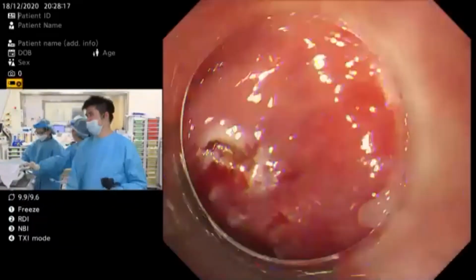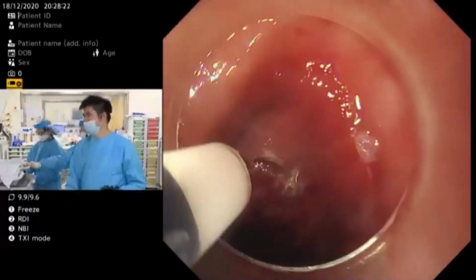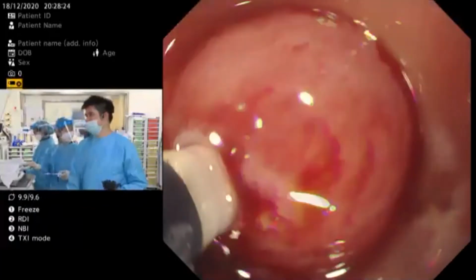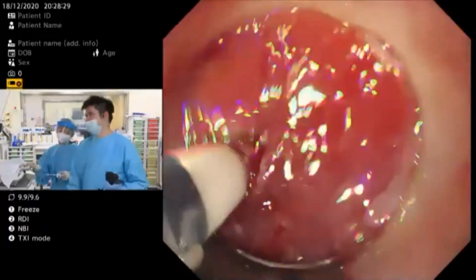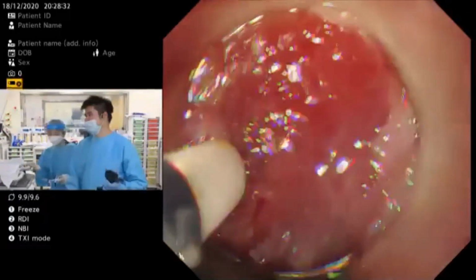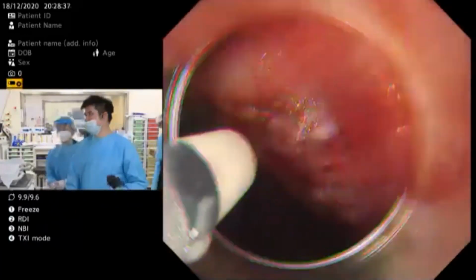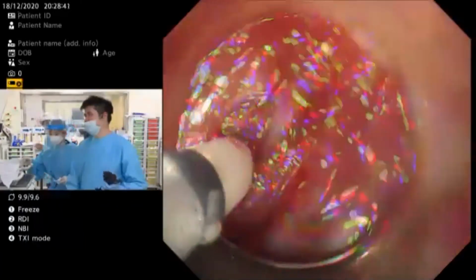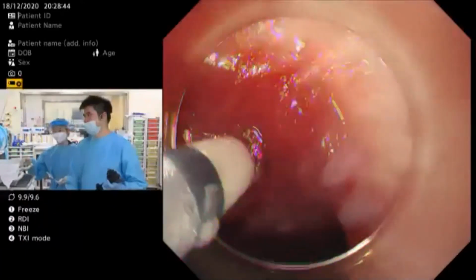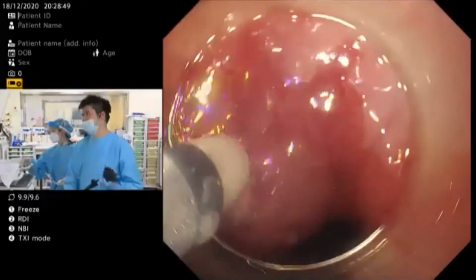I mean, so far it's cutting reasonably well, but when do you decide that you're going to use traction? At one stage, we'll say, this is not well, I need to use traction. So it will depend on, of course, the difficulty of the procedure and whether or not you can achieve a good retraction by the conventional method. Correct. If you cannot, then perhaps it's time to consider changing the tactics. So it's always a review of the progress of the procedure and decide what to do next.